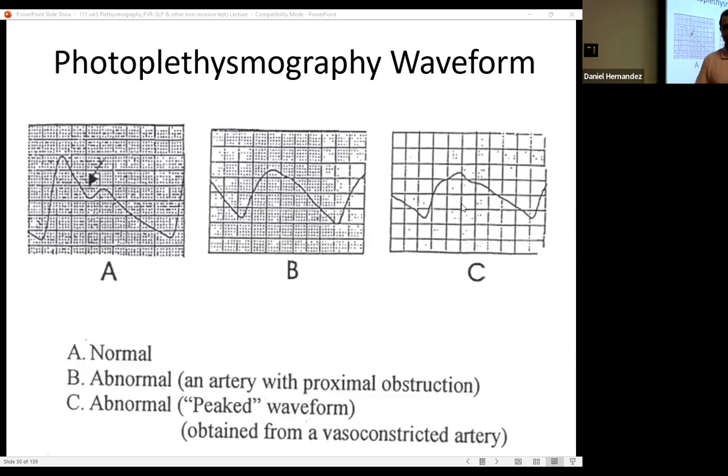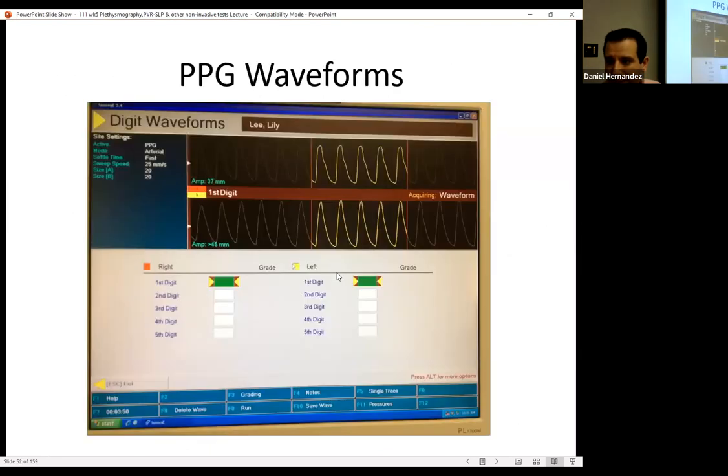We had a dicrotic notch on the other side, and then an anacrotic notch before it. Is it on the next one? Oh, it isn't, it's on the next slide. Yes, anacrotic.